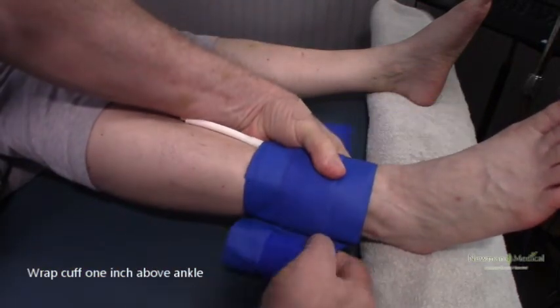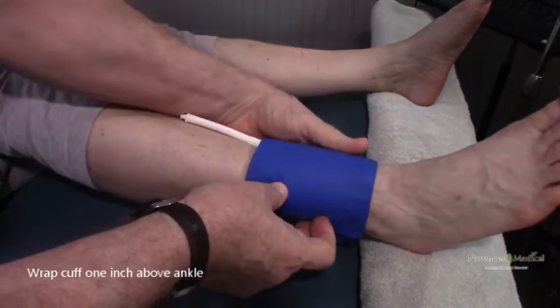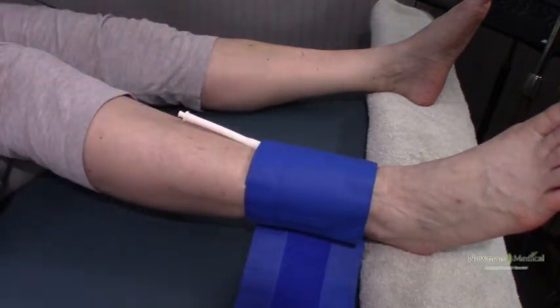You can rotate it around to get the hose out of the way of the artery. When wrapping the cuffs on the legs, the patient may try to hold their leg up to help, but ask them not to, because when they relax their leg, the cuff may loosen.